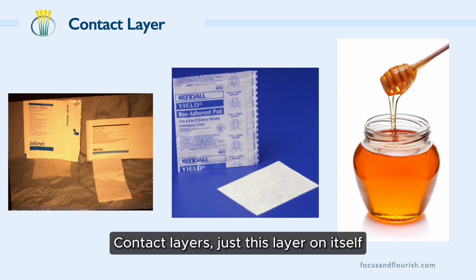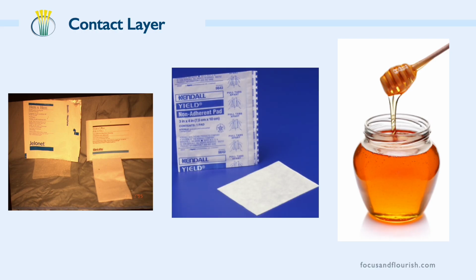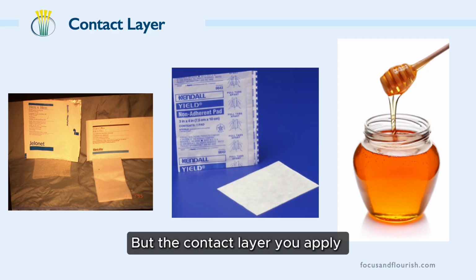The contact layer, just this layer on its own, is a whole seminar topic, and it belongs in the wound management lecture series, not just bandaging, all right? But the contact layer you apply when you have a wound or incision.